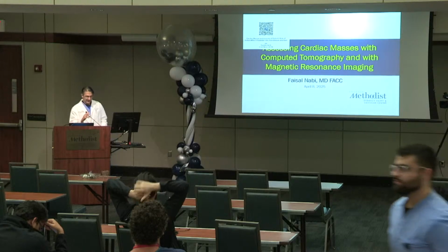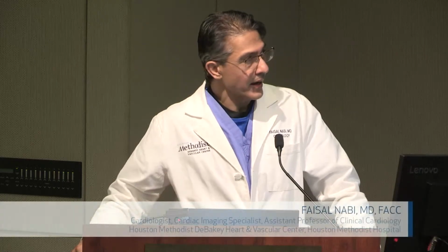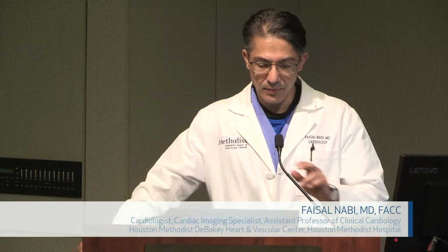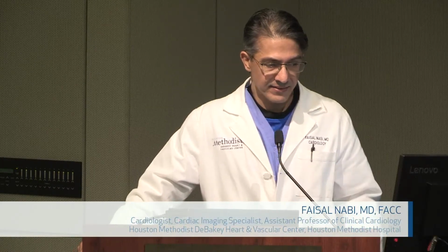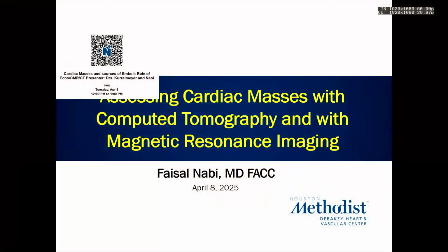All right, so I've been tasked with showing how advanced imaging can help in the assessment of cardiac masses, once you've completed your echo.